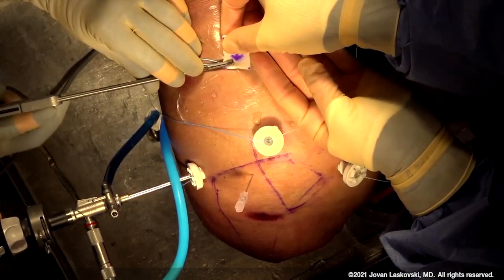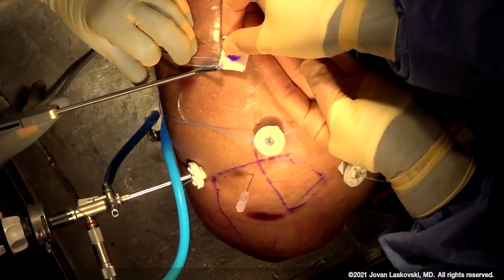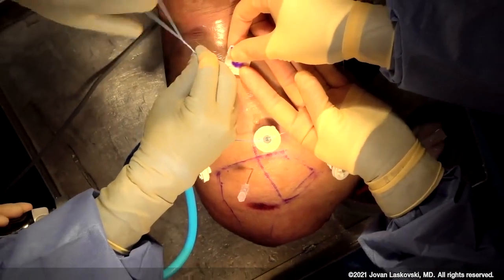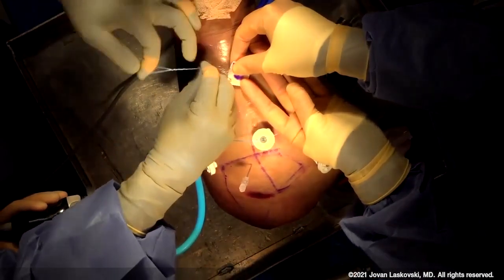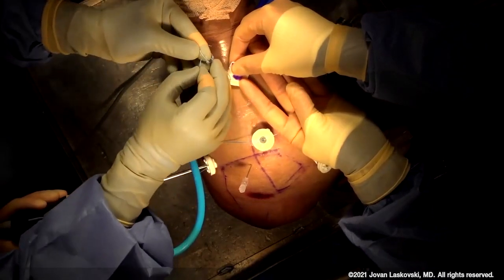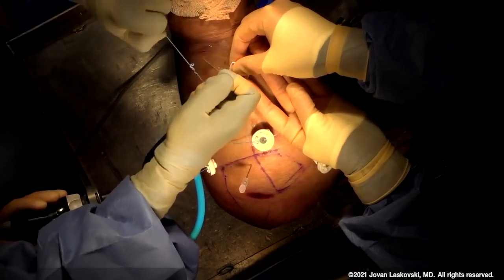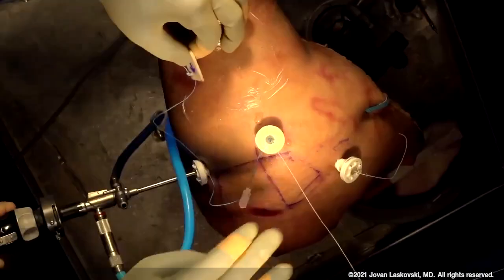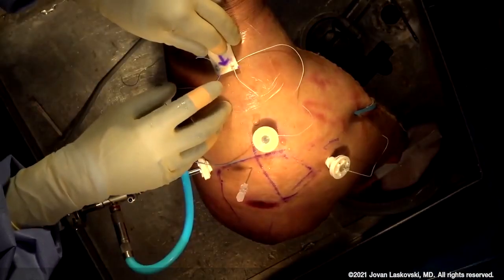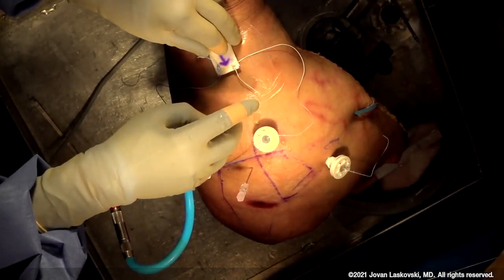There's a mark here, and I want that mark to be where the needle exits. You can tell we've got a very tough piece of dermal tissue. We're going to steal a little trick from Joe Burns of SCOE and tie a stick knot: make a little loop and twist this suture enough times where it almost cuts your finger off. Then place the limb through and dress it — it's basically a big, messy knot. Notice I'm being very diligent to keep these suture limbs separated.